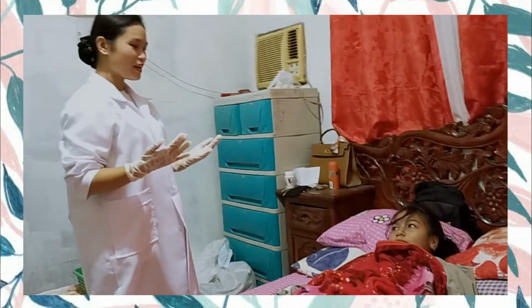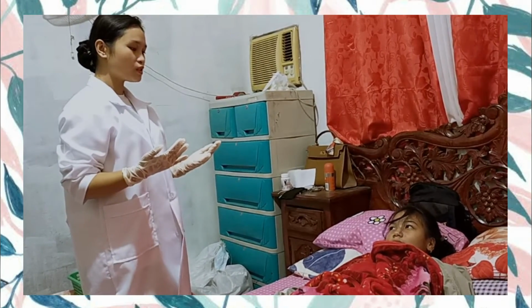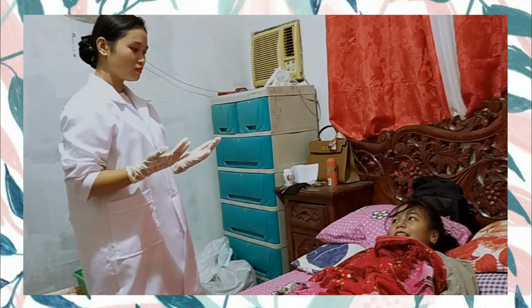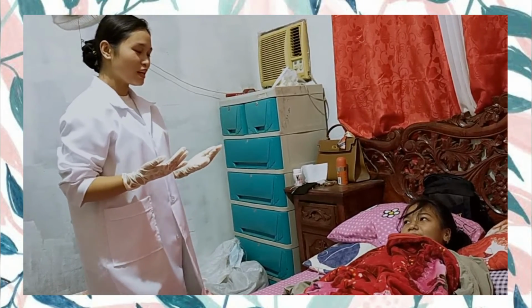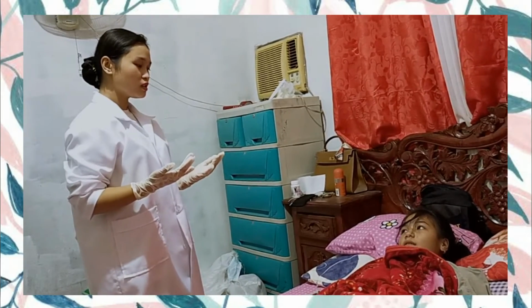Good day, my name is Princess Julia E. Dela, a student from Nueva Ecija University of Science and Technology. May I know what is your name? And what should I address you? Okay, so Berlian, today we will do a Foley catheter in your urethra. Is that okay with you?